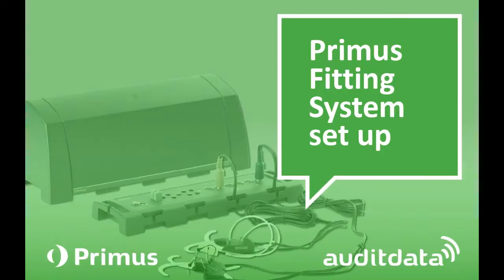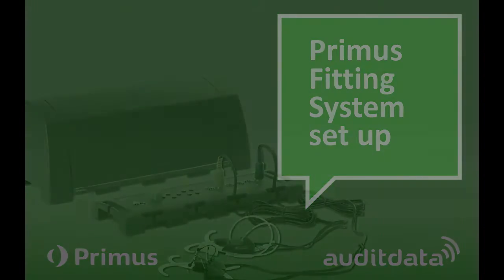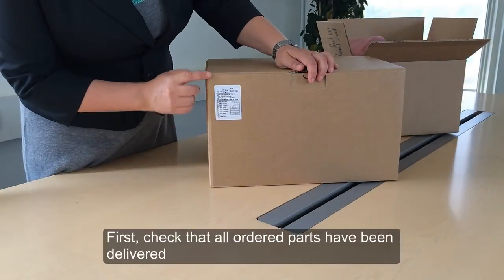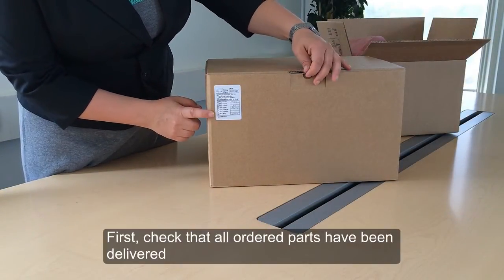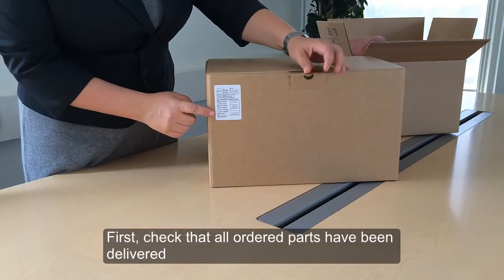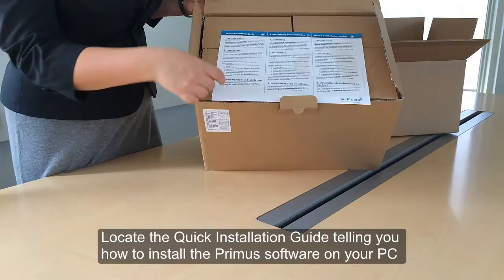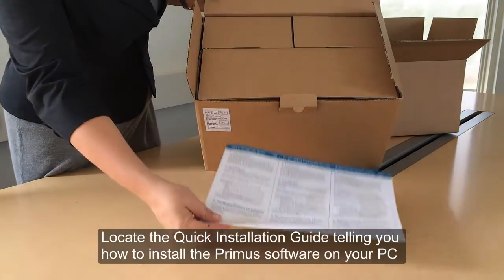This video will show you how to set up your Primus fitting system from delivery. When you receive your delivery, please check that all ordered parts have arrived against the order sticker on the box. Your delivery should contain a quick installation guide which describes how to install the Primus software on your computer.